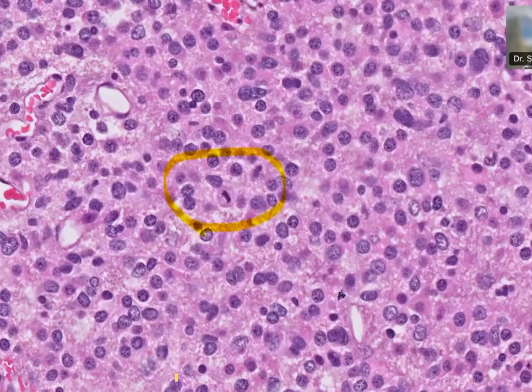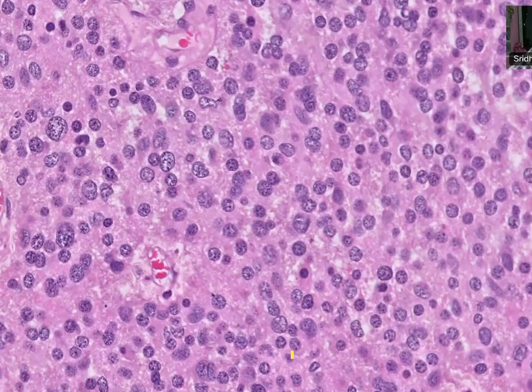Is this the one we are talking about? Yes, sir. So at this point, what is your call? These are other pictures. What is the great difference between the first case and here? You can see the cells are not too much irregular. They're rounded, more monomorphic than a pleomorphic population. The variation in size is there, but not shape-wise too much of variation.